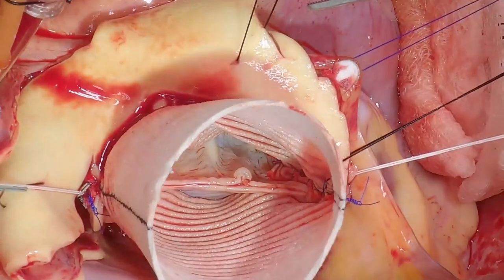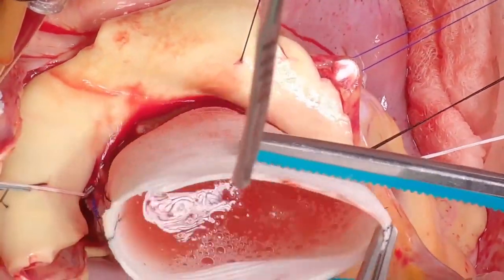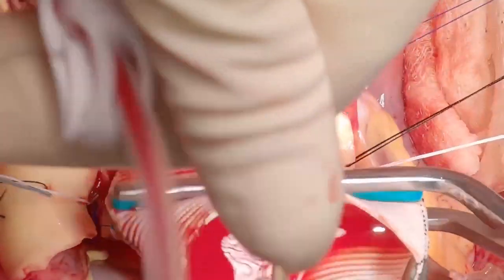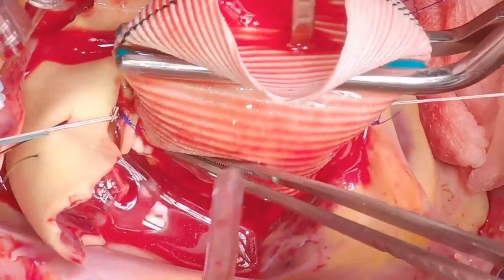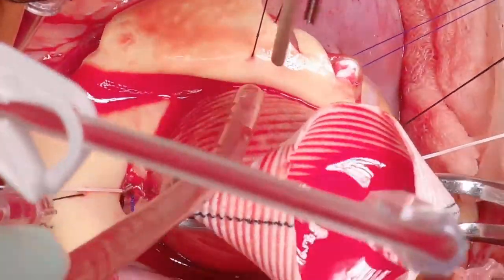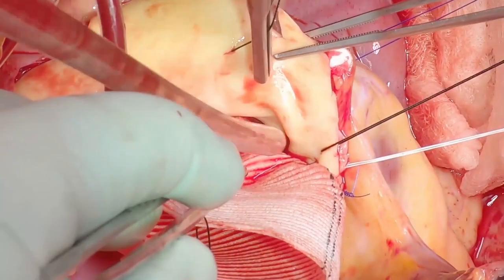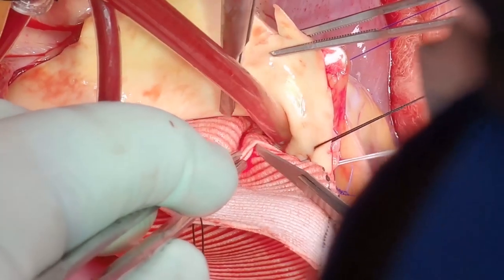The root now looks nice and symmetrical. You can test it with cardioplegia administered and the Fogarty clamp in position and check for any bleeding. At the non-coronary sinus it's very easy to put in additional sutures if needed. Then you can also look at the conjoint leaflet sinuses.